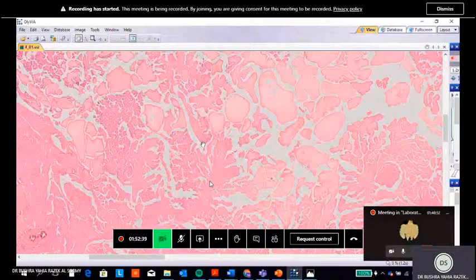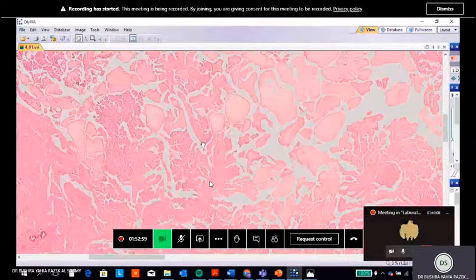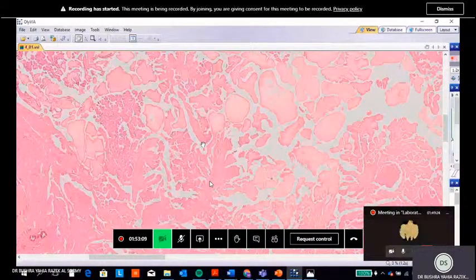So what is the lesion that you see? It is a neoplasia. Describe the growth pattern in the lesional area: it is a papillary structure. Describe the lining epithelium and characteristics of the nuclear features. We said optically clear nuclei, grooves, pseudo-inclusions. Can you find psammoma bodies? Yes, we can find them. Your diagnosis is thyroid papillary carcinoma.